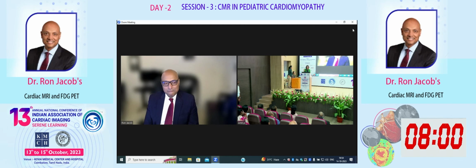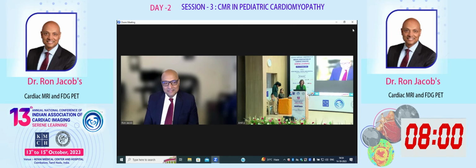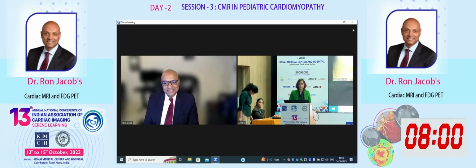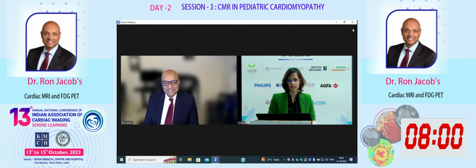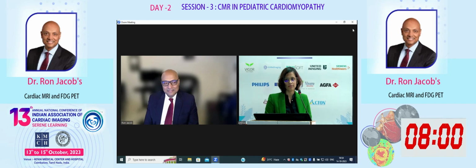focal edema, then however many ROIs you do, or even if you do a global ROI on the myocardium, you don't end up getting it. Even the mapping was normal in this. I think we are using Circle and we get the segmental map. Yeah, and that's very helpful actually.